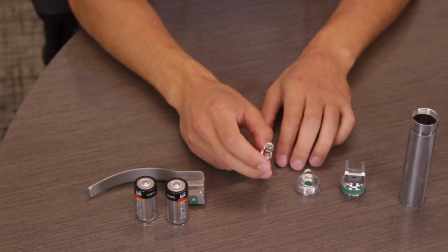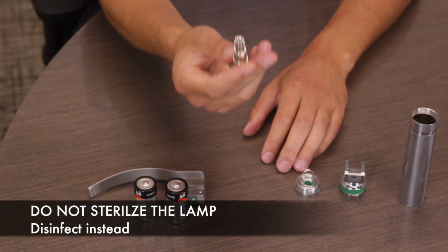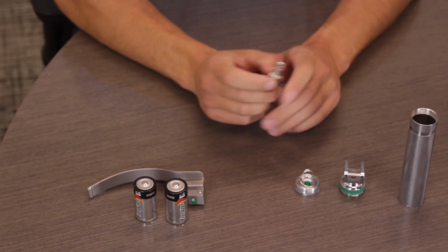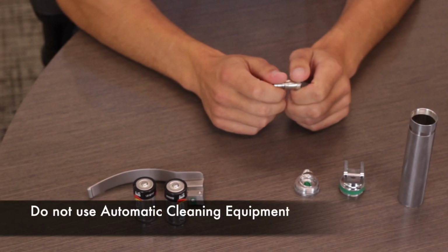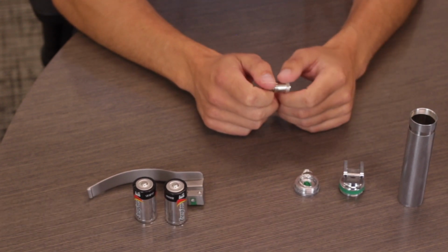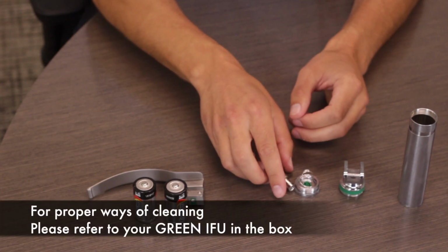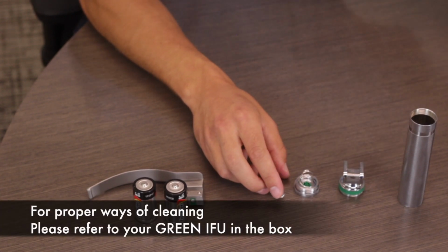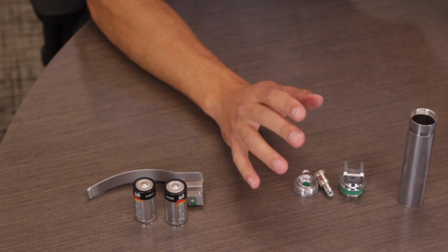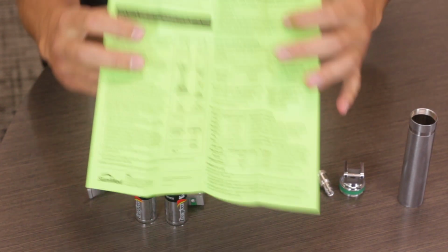A couple things to note. The lamp cartridge cannot be sterilized. It's meant to be disinfected instead. Secondly, SunMed does not recommend the use of automatic cleaning, ultrasonic cleaning, dry heat sterilization, or potassium hydroxide liquids. For all the recommended cleaning procedures, please consult the SunMed IFU, which can be found in every single laryngoscope blade and handle packaging. There's a green document that looks like this.